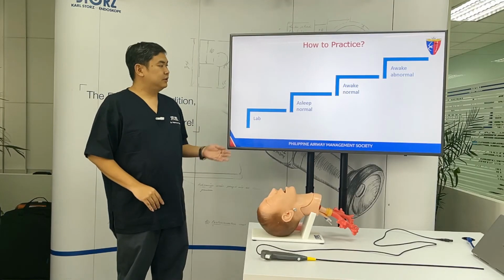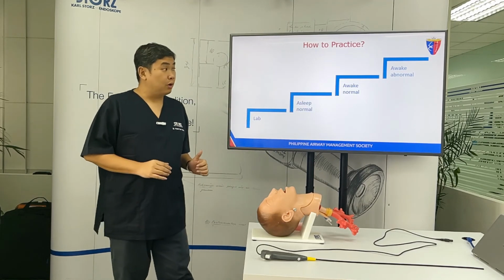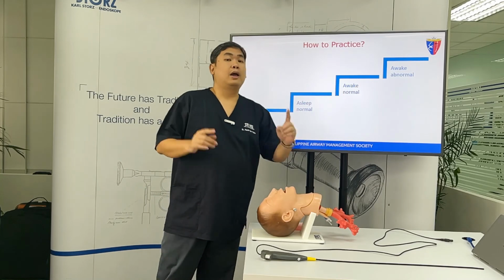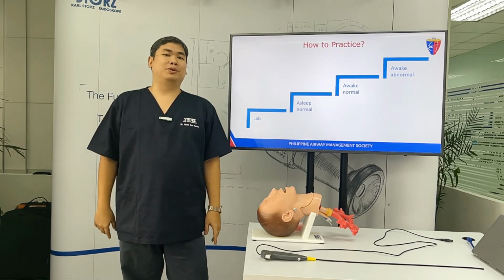After you have mastered these first 3 steps, now you could proceed on performing awake, flexible endoscopic intubation on patients with abnormal airway.